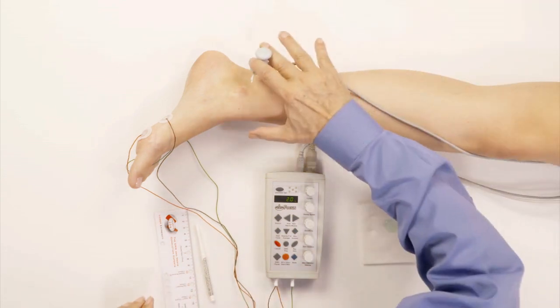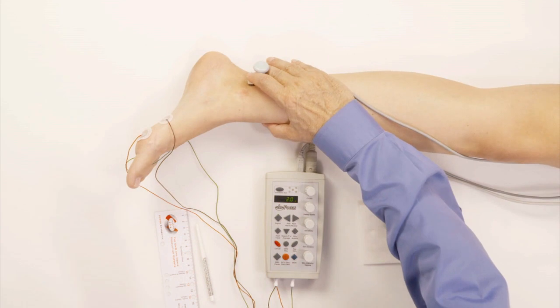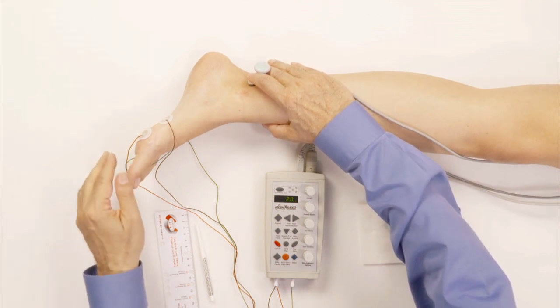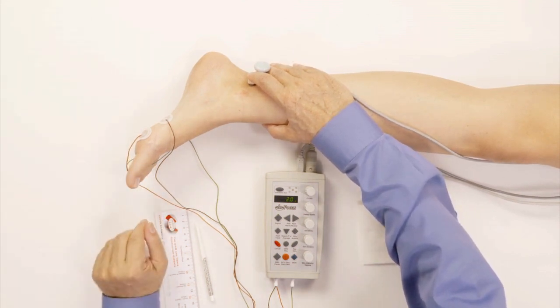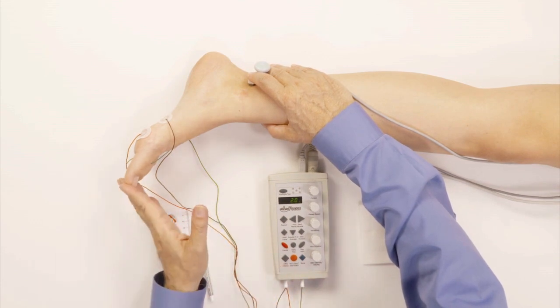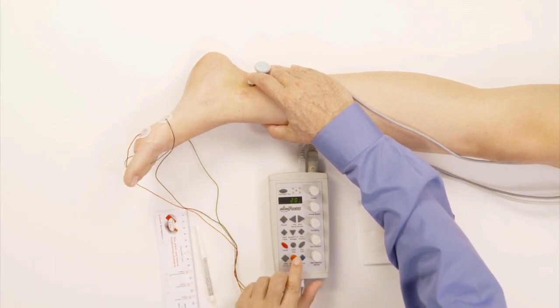The tibial nerve flexes the foot forward like this, and of course, the toes forward. As soon as I start stimulating, you should see the toes flexing forward.